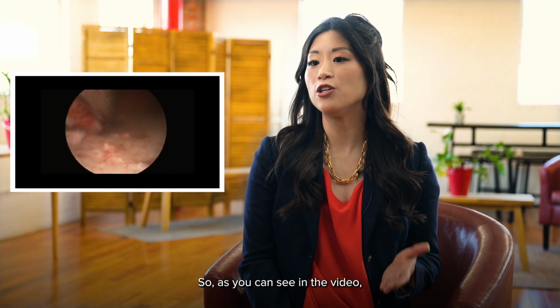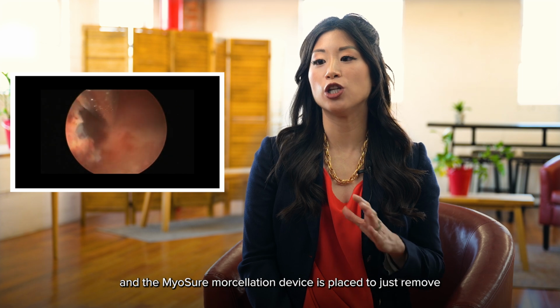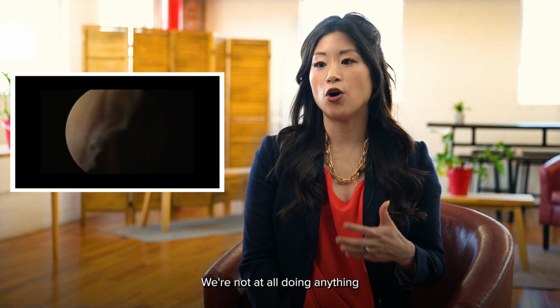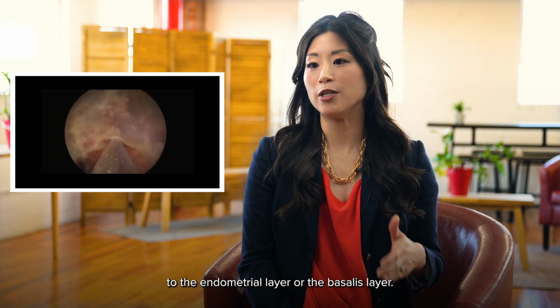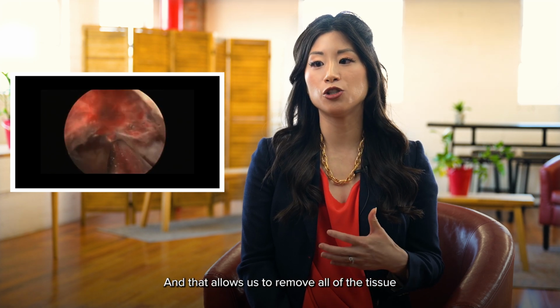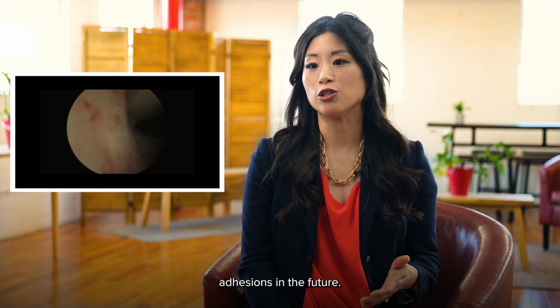So as you can see in the video, the hysteroscope is inserted and the MyoSure morcellation device is placed to just remove the abnormal tissue or the products of conception. We're not at all doing anything to the endometrial layer or the Basalis layer, and that allows us to remove all of the tissue without increasing the risk of intrauterine adhesions in the future.